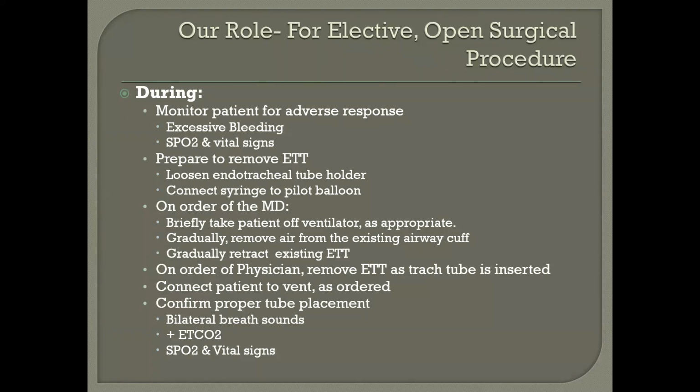Long story short, the patient's airway was so swollen, probably from their COVID infection, that we later reintubated the patient with a bronchoscope with a 7.0, and the patency of their airway looked like a crescent moon. And I remember the physician held off, and I just took it with his hand, and we just advanced it right through what we could. It was one of those things.